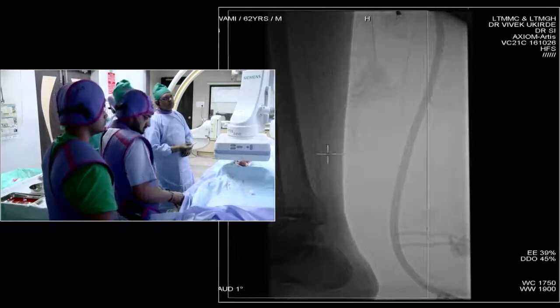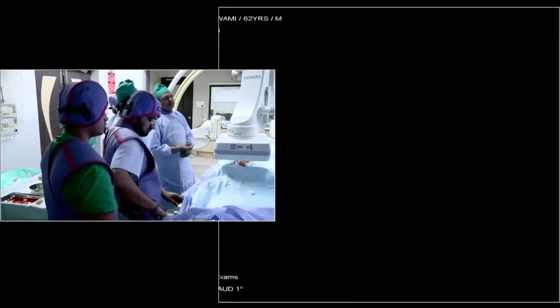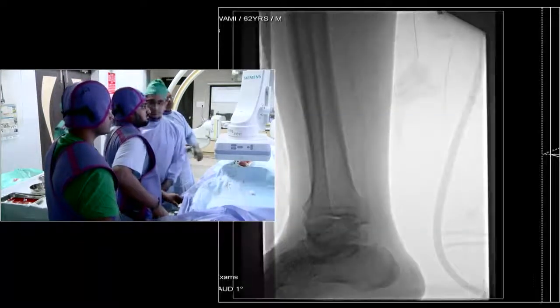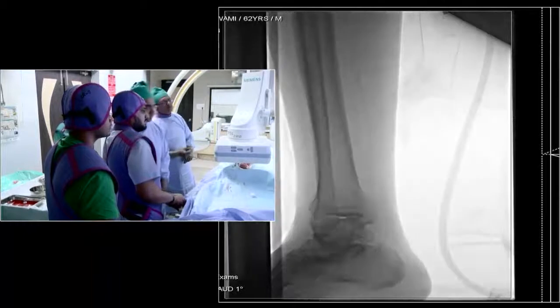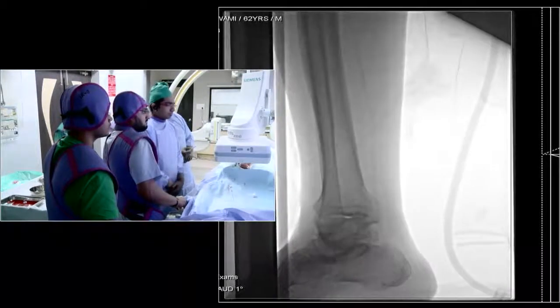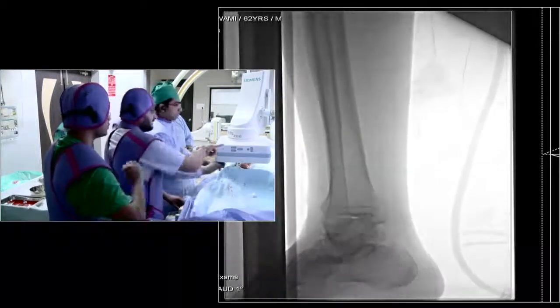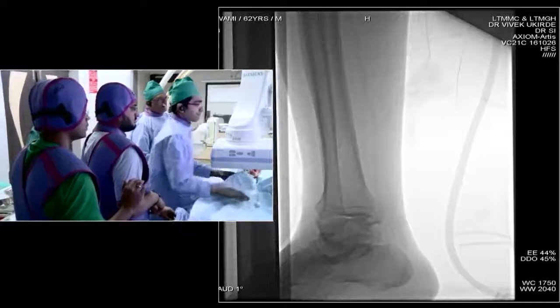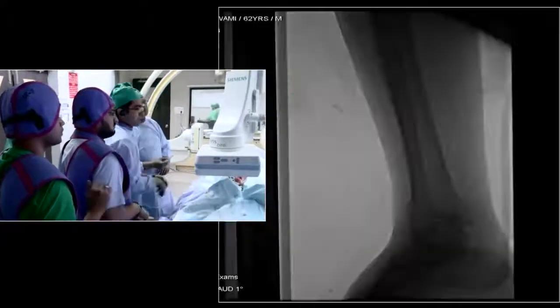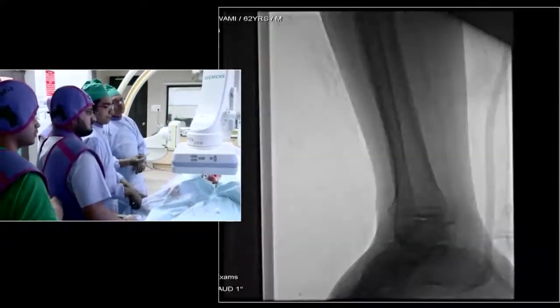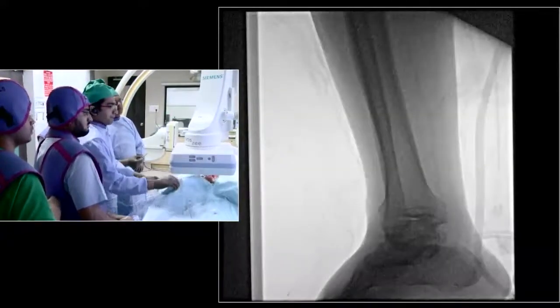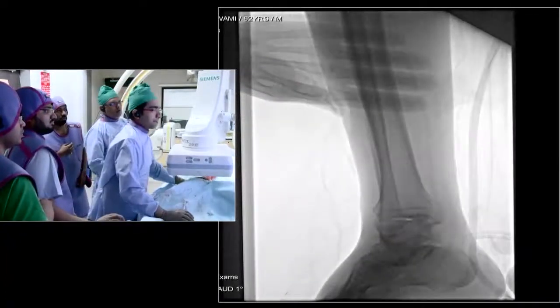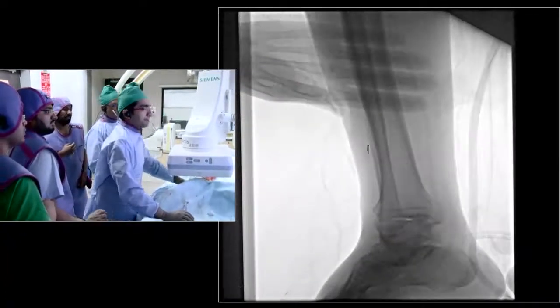Note the flat panel screen size for peripheral — it is a 14-inch flat panel as opposed to the 9-inch used for coronary, so that in one image you can see the whole field and zoom in.